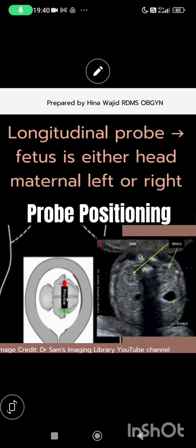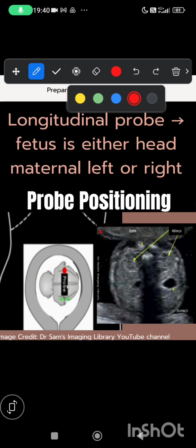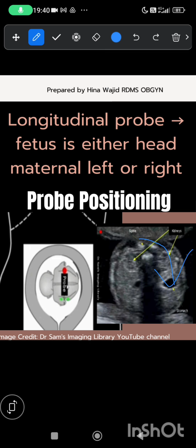Whenever the probe is placed longitudinally, as you can see here, and you get this transverse section, it's either transverse head maternal left or right. Now here we can see their relationship is clockwise. So it's head toward maternal right or left? Right. Exactly. Right.